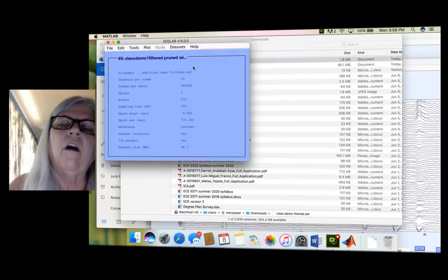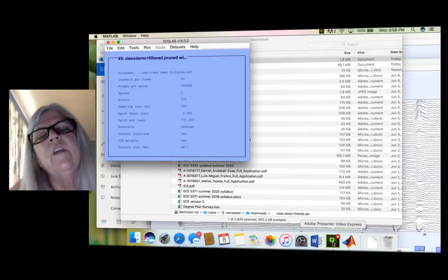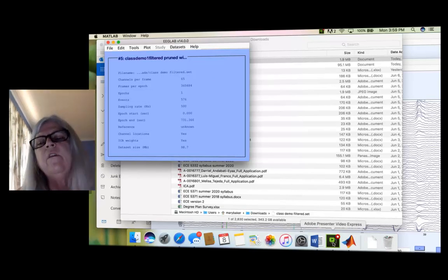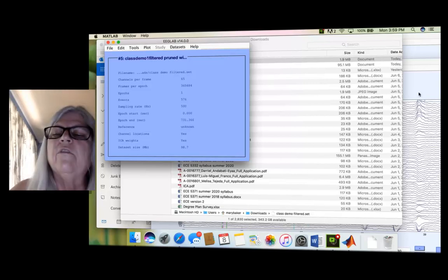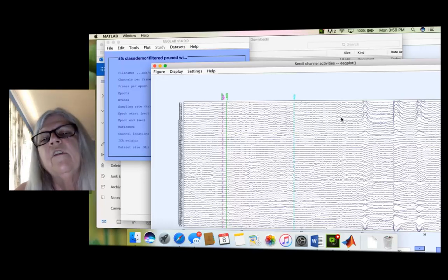Okay, I'm going to cut it off at this point on the video because these are difficult to process if they get too long, and I know they're also difficult to listen to. What we're going to do next, I'll probably have the video up in a day or so, is we're going to look at these markers and try and figure out if we want to start analyzing some data and making some comparisons. Now that we've got our data cleaned up a little bit, we might want to figure out what is the best way to do this.